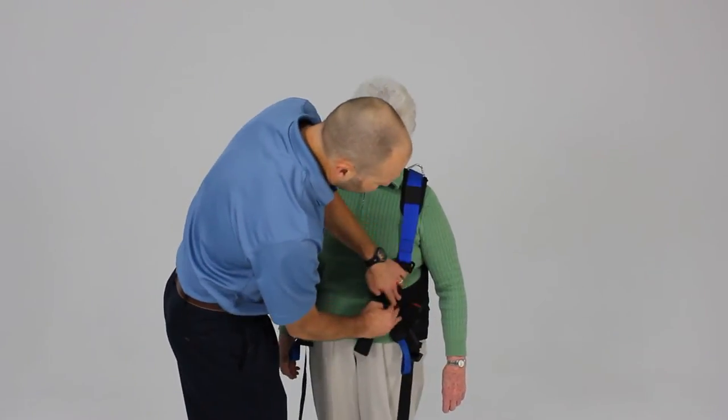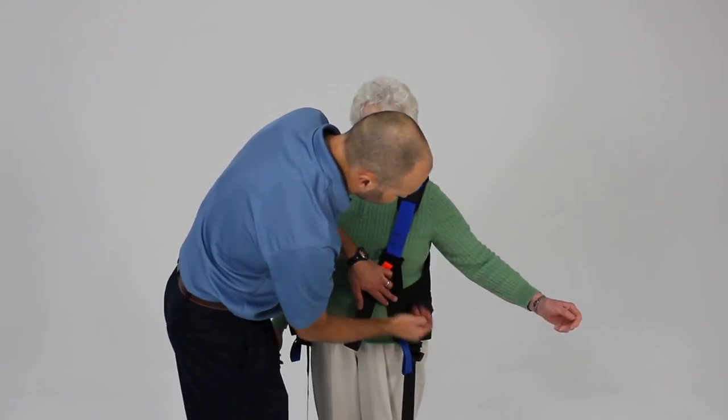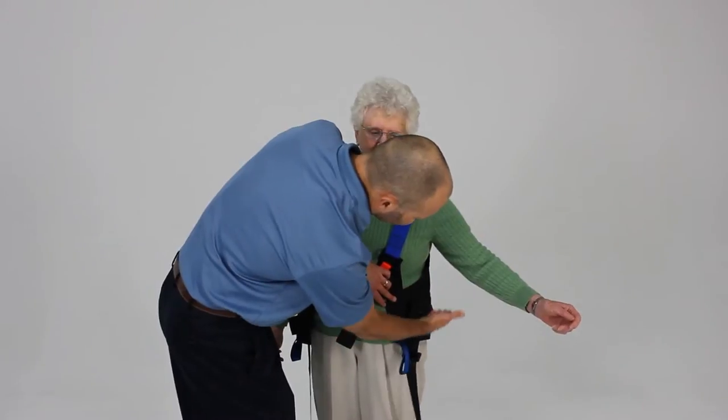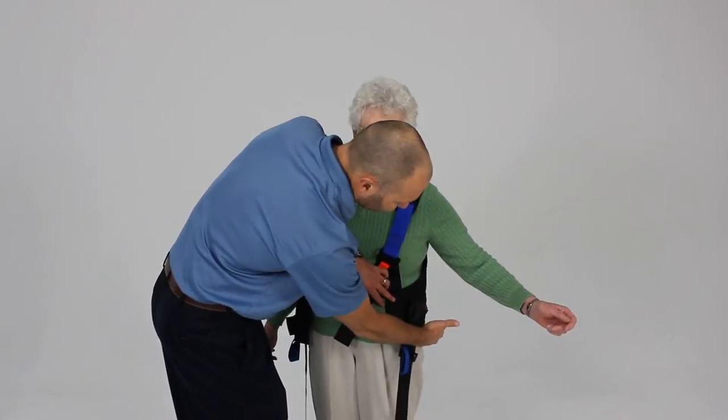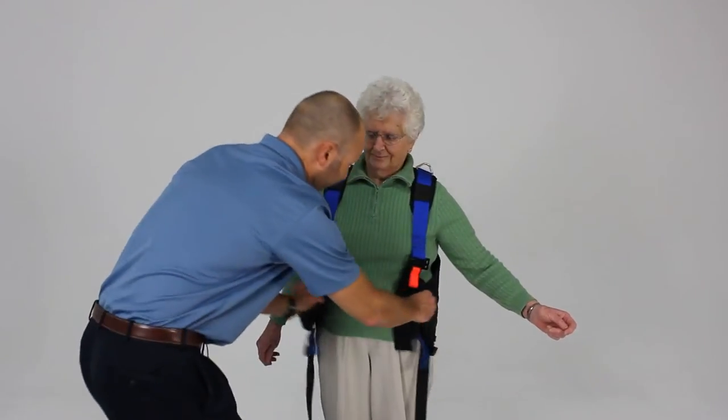You would like the belt to be placed in a position where this angled edge catches underneath the angle of the ribs, and the lower edge just comes down below the iliac crest and just right around the greater trochanter area, so you get a good anchoring point.